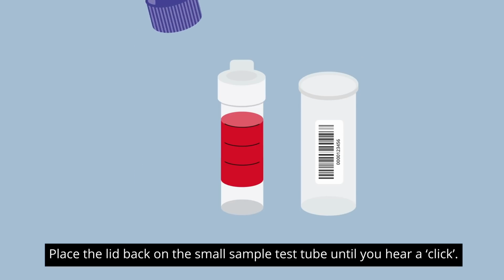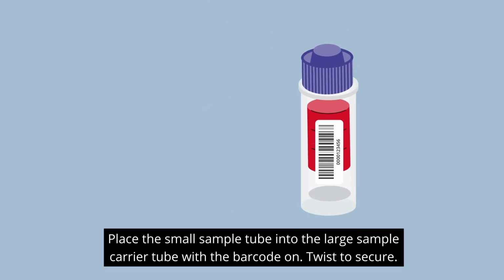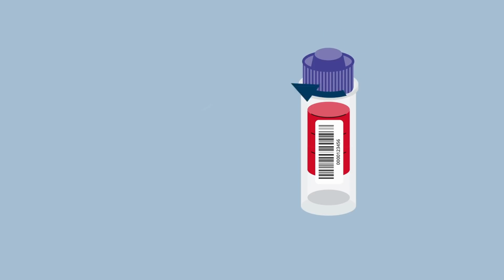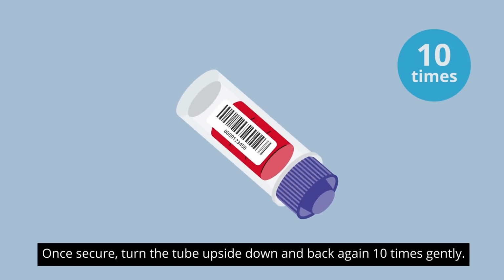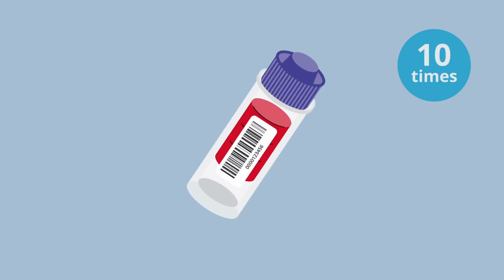Place the lid back on the small sample test tube until you hear a click. Place the small sample tube into the large sample carrier tube with a barcode on. Twist to secure. Once secure, turn the tube upside down and back again 10 times gently. Be careful not to shake.